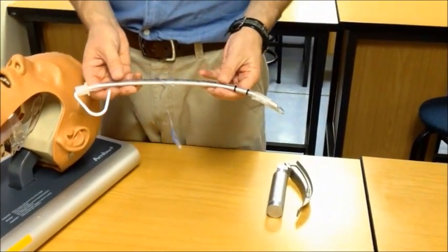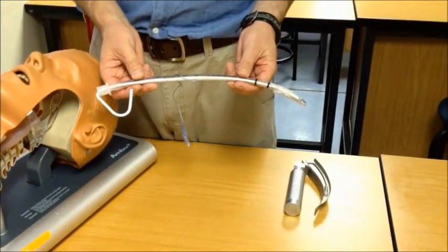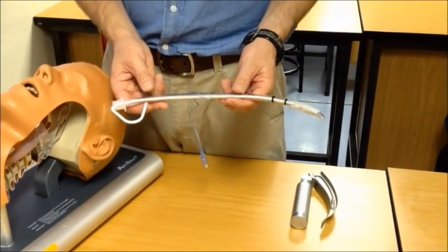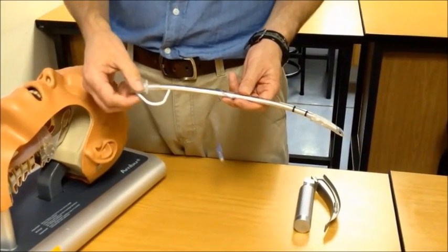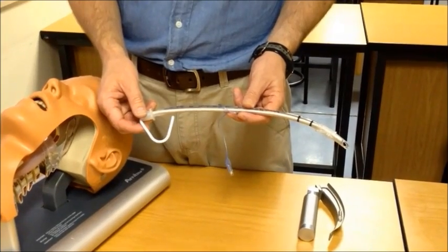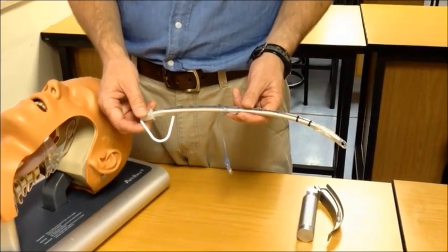Even though the ET tube is now removed from the packaging for me to demonstrate the skill to you, in reality you would keep it inside the packaging, opening only the one end to give access for the stylet. Please refer to video part 3 for proper handling of equipment around intubation.